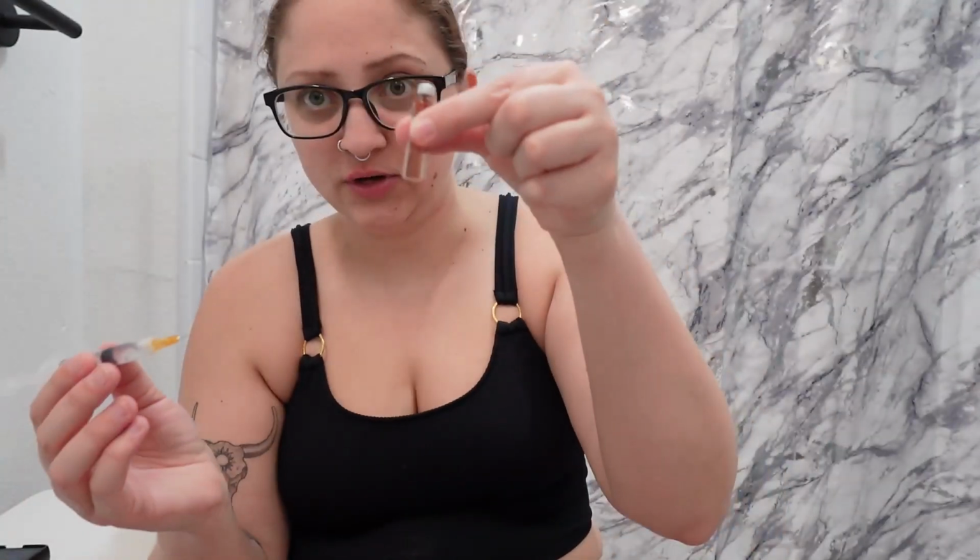Okay, please hold. Okay, I'm gonna do something a little bit different, but just because I don't want to mix my bottle that's been out for so long versus the bottle that's been in the fridge, what I'm gonna go ahead and do is load up what I have in the syringe and put it in my cartridge and then kind of go from there. It actually got me quite far, but I think I need another, I really want to say another like 50 or so units, because look at her.